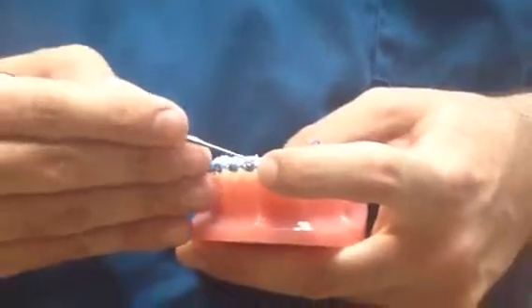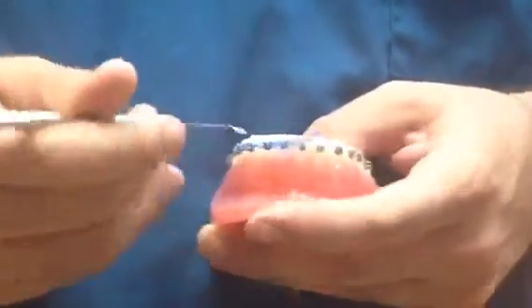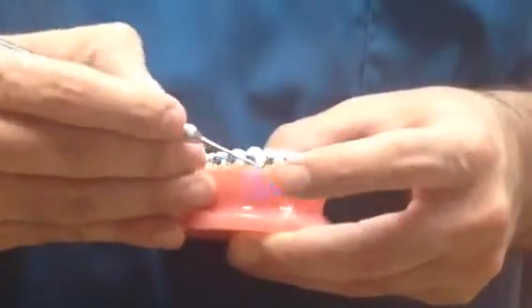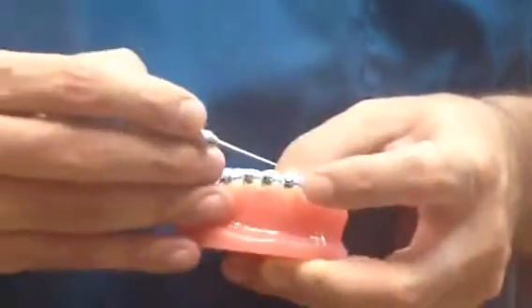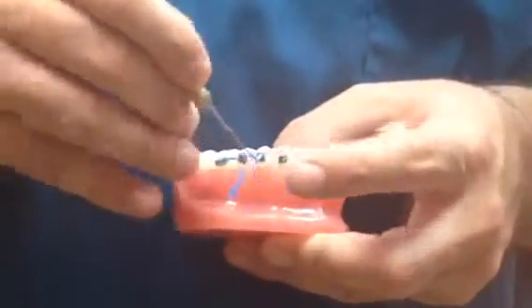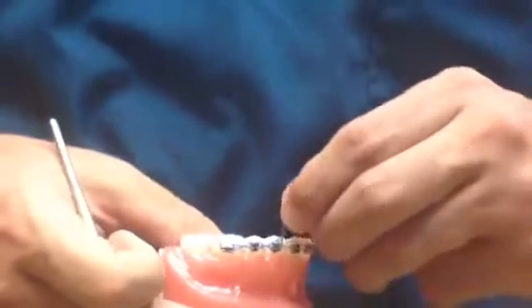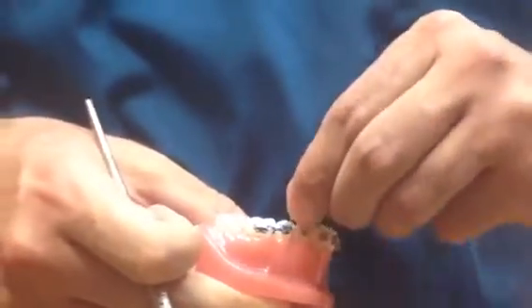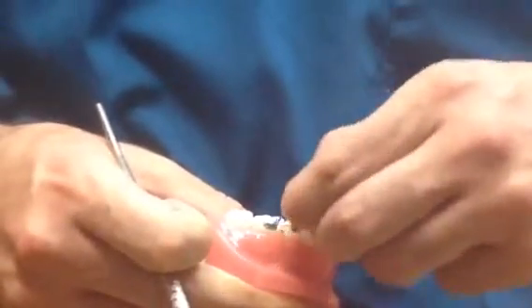As you can see here, you can use your fingers for stability and be careful not to poke yourself. If you don't see that you have this tool and you cannot find it, you can easily remove the power chain with your fingers, as so. And there you go. Good luck.